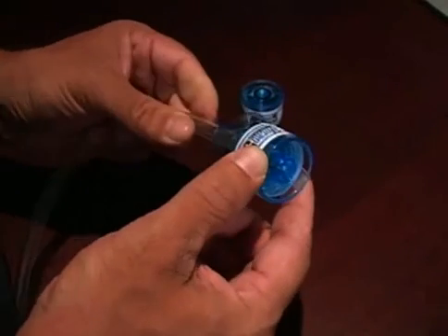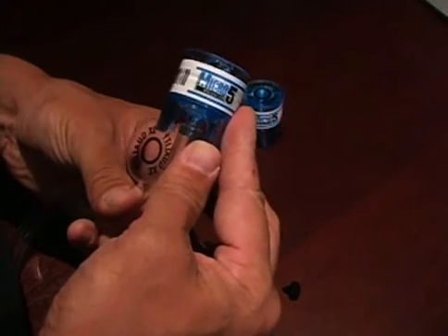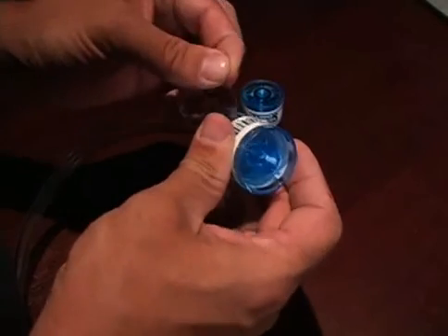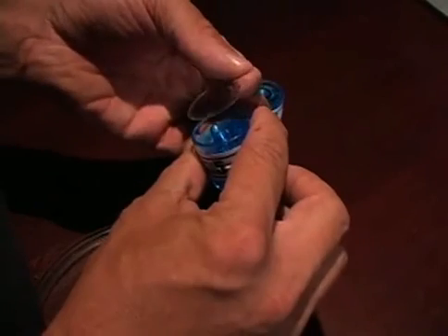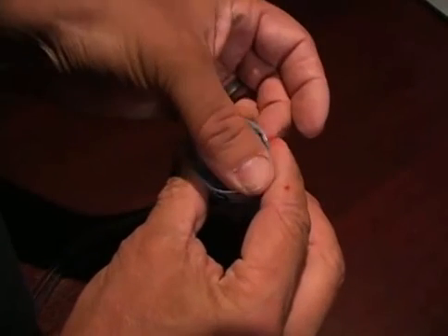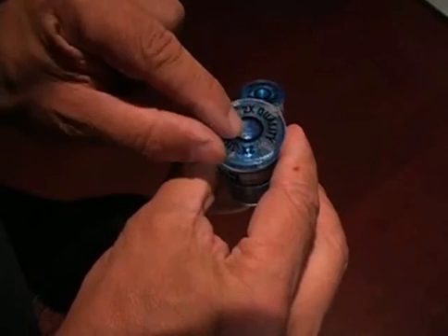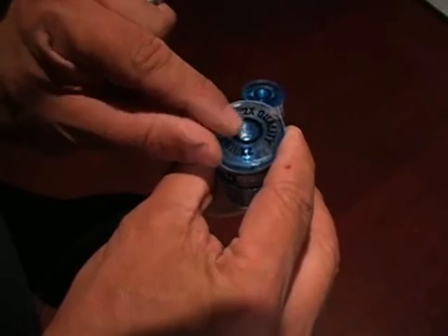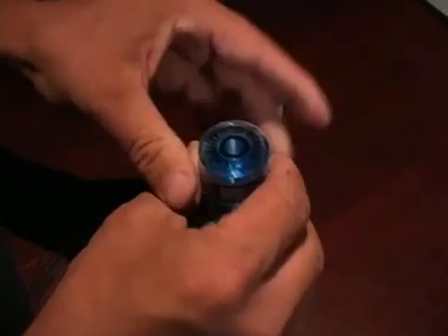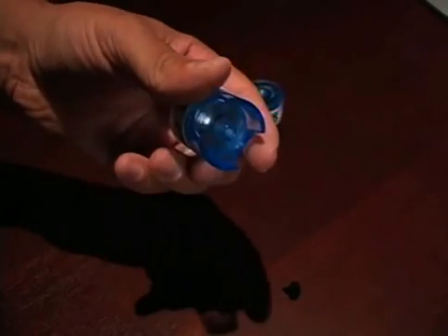When the sampling is completed, turn off the pump, replace the seal like that. Make sure there's a good seal. It's really this area here. It's not the perimeter. It's just this area in here that you want sealed up. And then disconnect from your air pump source. You've got your pin in a nice clean location. Just going to replace it. Put it back in there.